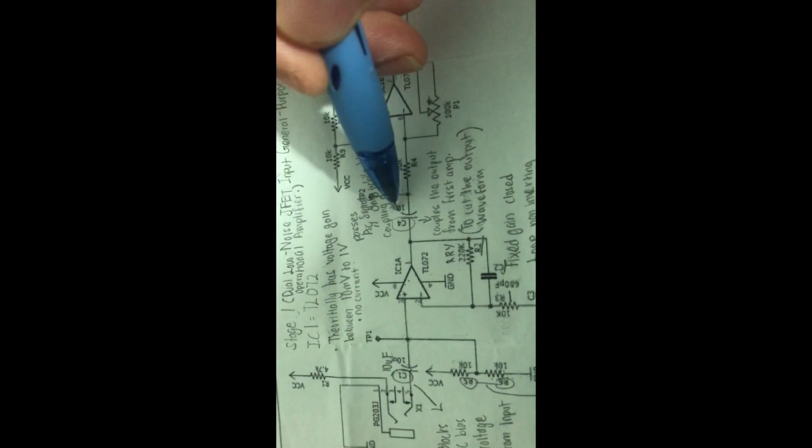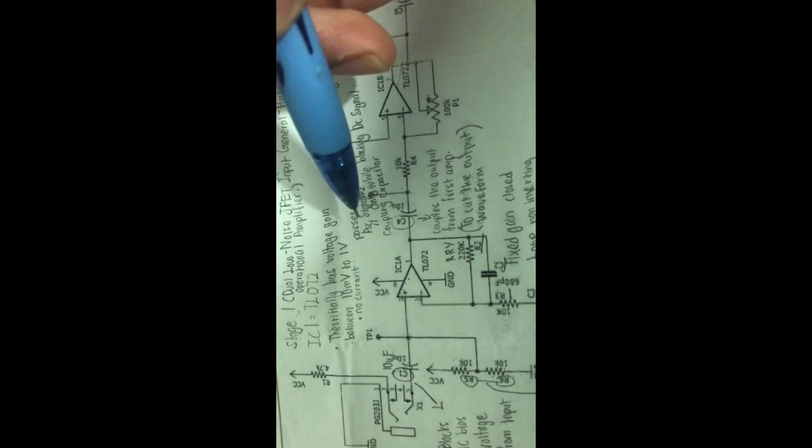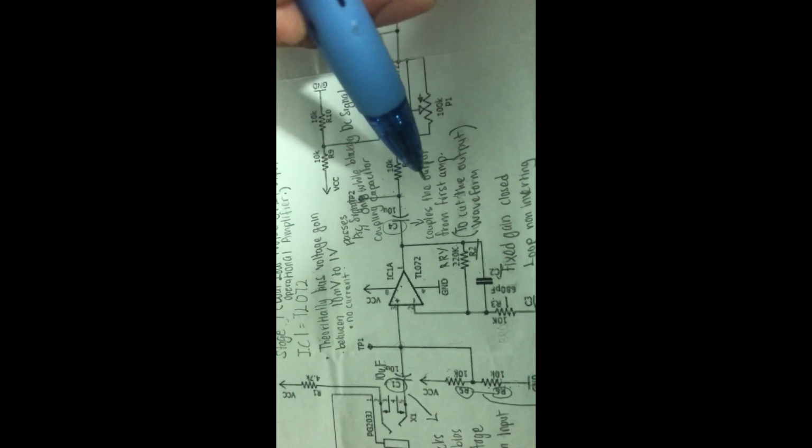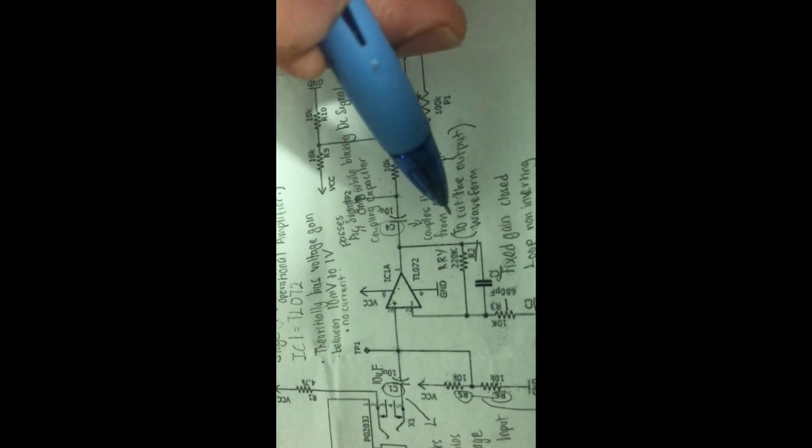The pass band gain is 220k over 10k plus 1, which is 23, calculated with the formula R2 divided by R3 plus 1, equal to the pass band gain, which in our case is 23. Okay, so we have another capacitor, C4, here. What is the main purpose of this C4? It passes the AC signal on while blocking the DC signal. It is a coupling capacitor, which couples the output from the first amplifier stage to the output waveform. So that's basically it for the first part.